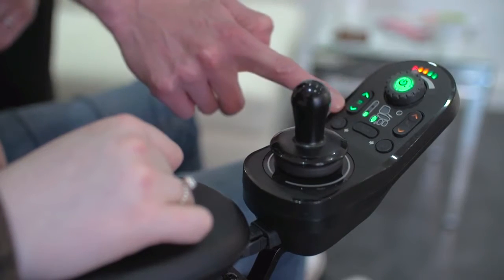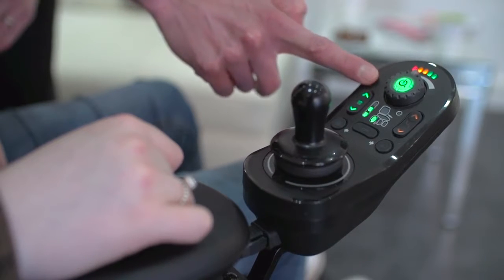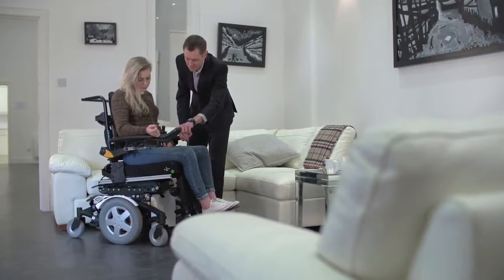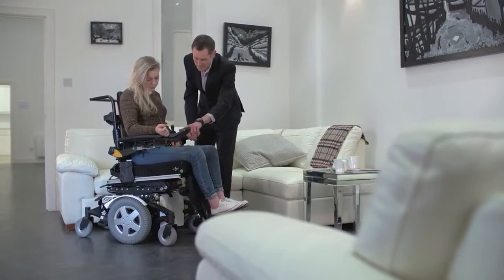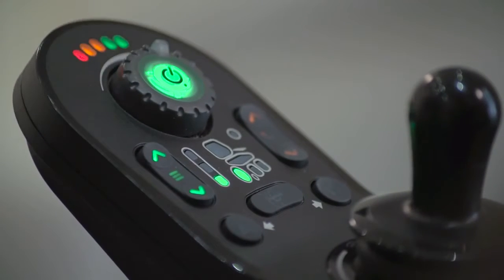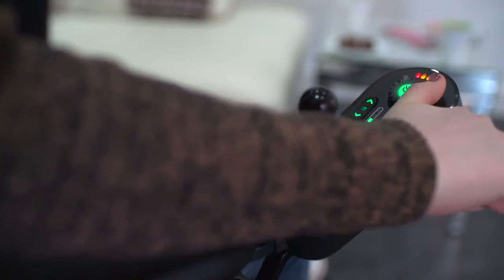The drive button accesses different drive functions that can be customised by the power chair provider to suit the user. Functions such as indoor and outdoor can be accessed here. The speedpot built into the on-off button can be used to adjust the maximum speed within a drive function.